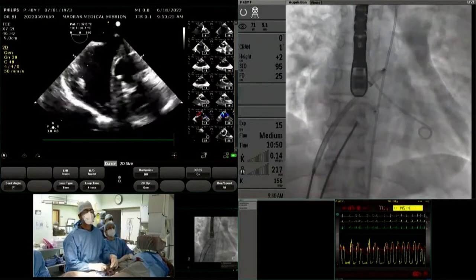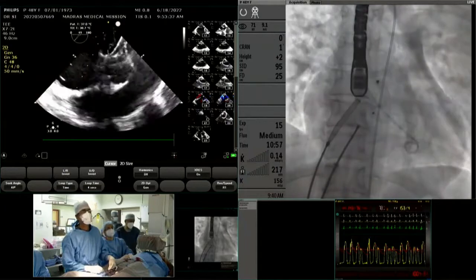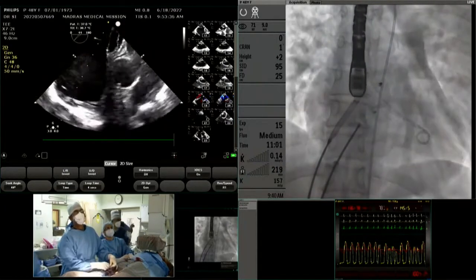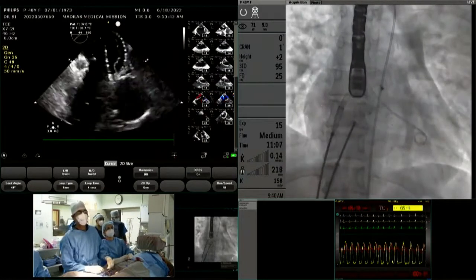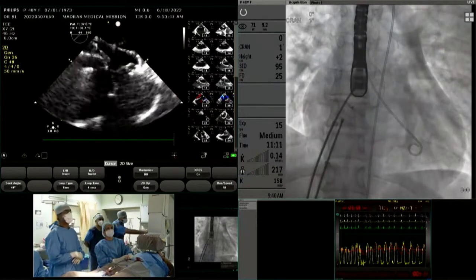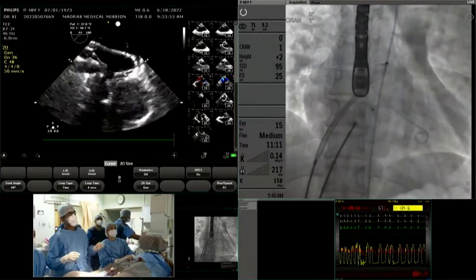If you go to 45 degrees of fluoroscopy, echocardiogram. Yeah, that's very nice. 45. It's prolapsing, Nagesh. Yeah, I can see that. Can you, Shiva? Yeah, so now, can you anchor it somewhere? Let me rapidly deploy. Or else you deploy. Yeah, that's right. I have deployed mid-LA position. That's a nice rapid maneuver. What Dr. Sivakumar has done, rapid maneuver.